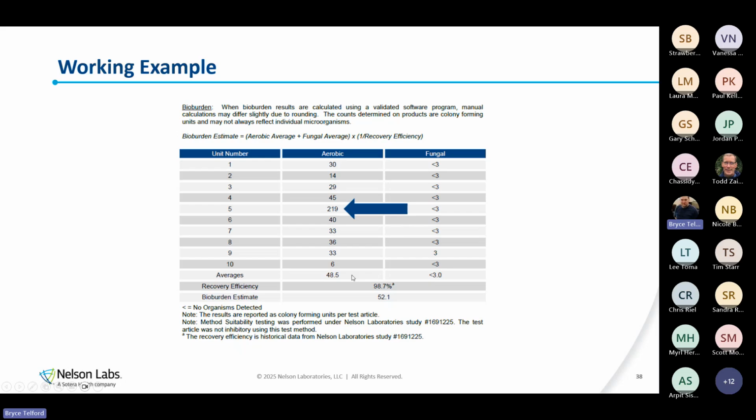So that's probably something we should take a look at and see, again, do we have an indication of an infrequent occurrence of an issue? Am I seeing something that is causing a high bioburden once in a while? Now, this doesn't necessarily mean that I have an issue with my product and sterilization, which is why a dose audit is 2 parts. When we talk about radiation and dose audits, there's the bioburden and there's the test of sterility. If the bioburden is high, that's potentially concerning and we should investigate it, and it can affect sterilization.